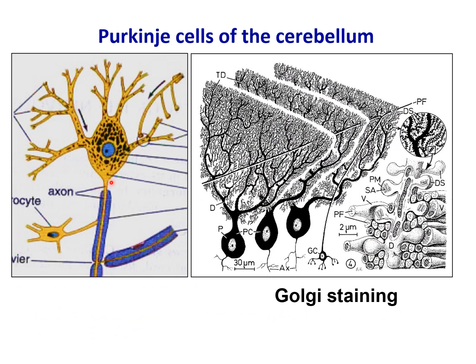As I was mentioning about the dendrites of the Purkinje cells, see the vesicular bodies, or the soma of the neuron, and it has a bigger dendritic tree, just like the branching of the banyan tree or some other trees. These Purkinje neurons are very big neurons, and one can see the Nissl granules, and these arrows indicate that it carries impulses from the periphery to the center.